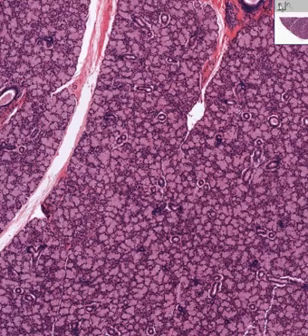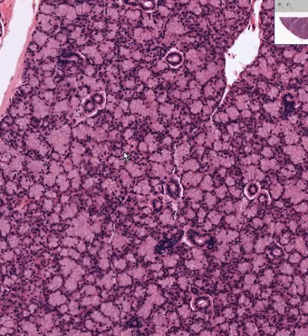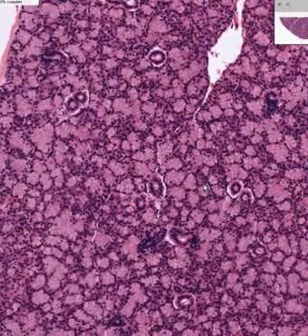Notice that in contrast to the parotid gland, which was 100% serous, and the submandibular gland, which was 50 or 60% serous, this particular gland is almost all mucinous. So this, by definition, then makes it a sublingual gland. And like the other ones, it does have a few serous elements or acini left, but most of them are mucous. You could see a lot of intralobular ducts with abundant cytoplasm, and perhaps with some striations on it, or striated ducts.